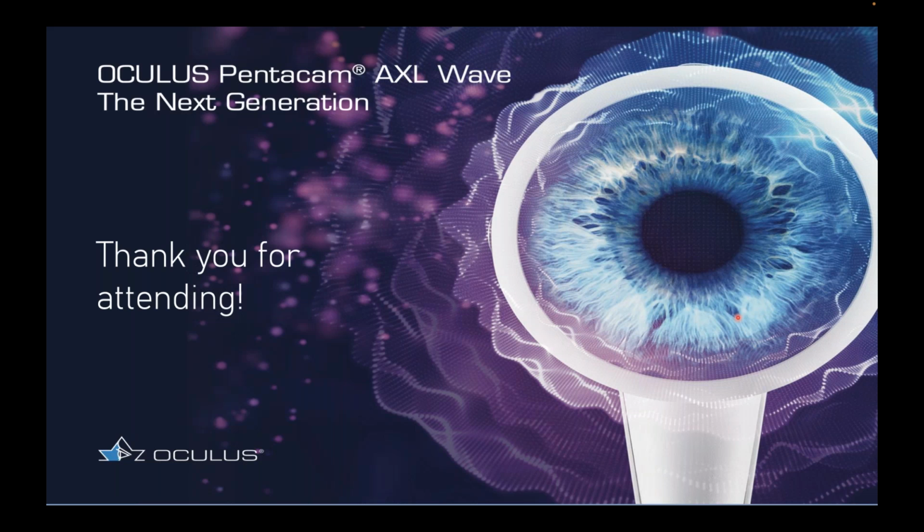I've even had several patients over the last few years where we may have gotten a Pentacam on them prior to fitting them with other lenses, and we fit them with just diagnostic lenses, and they didn't really work as well as we'd like. They maybe decentered a little bit. And so we went back, even a year later, and picked up their original map from before we ever started. We designed them lenses using that full corneal data with more of a custom approach, and we didn't even wash out the patients. We just switched them midstream, and you could see after a week or two things centering up better and getting a better outcome. So yeah, there's no question that what we accept as an acceptable outcome has changed.